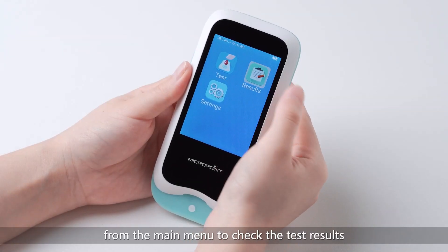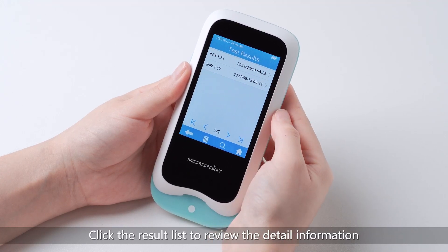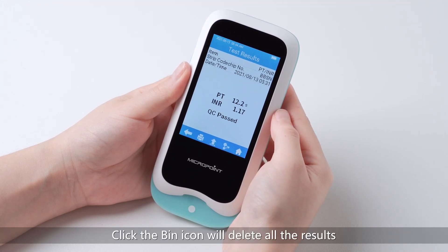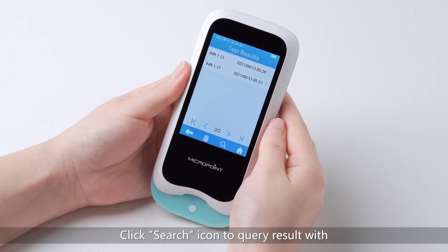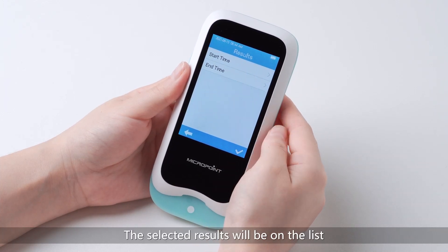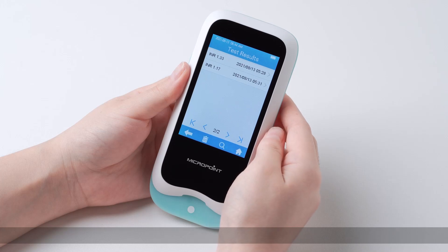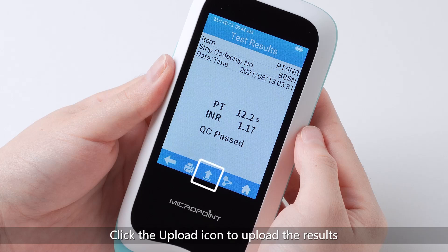Click the Results icon from the main menu to check the test results. Click the result list to review the detail information. Click the bin icon to delete all the results. Click the search icon to query results with a start time and end time, then click Check to confirm — the selected results will appear on the list. Click the print icon to print the results when the Q-Labs is connected with E-Station 2. Click the upload icon to upload the results while the Q-Labs is connected with DMS software.